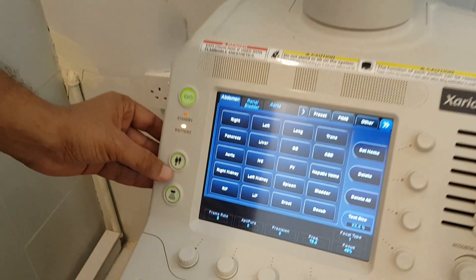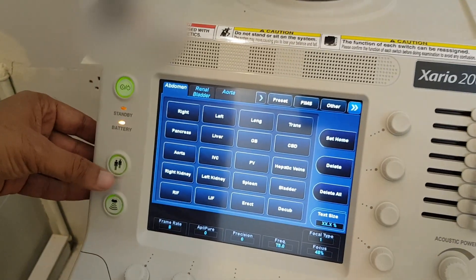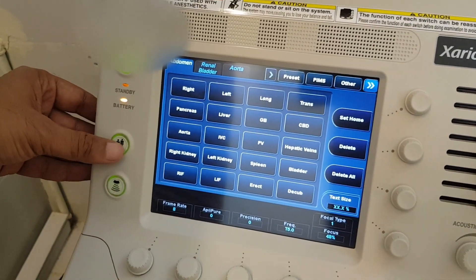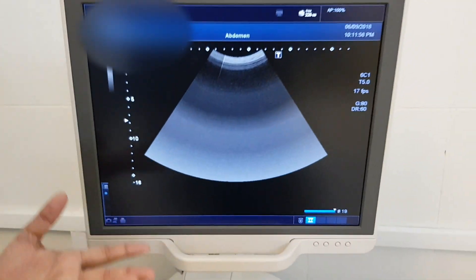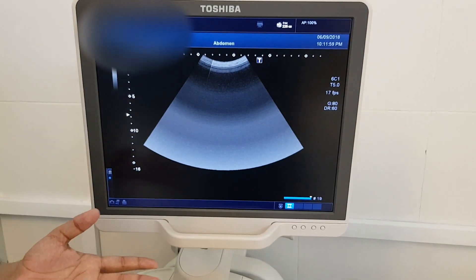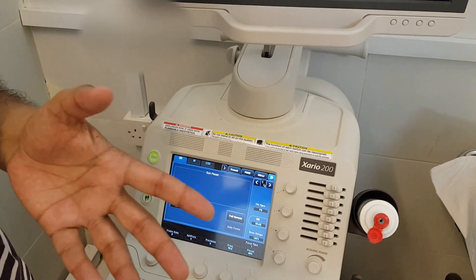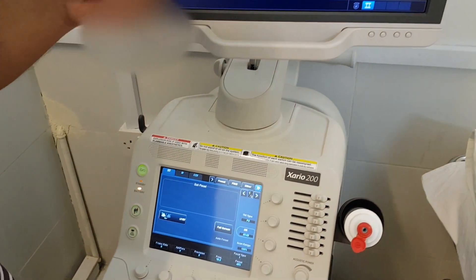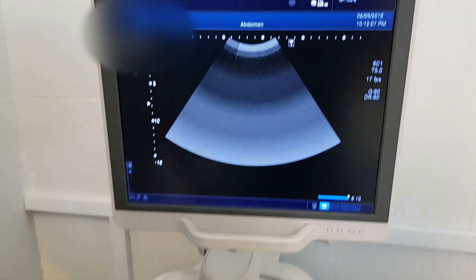This button, which is made of a human figure, when you press it, the new study starts. Whenever you are going to start a new scan, you will press it, so the last information, which is in temporary memory, will be released.